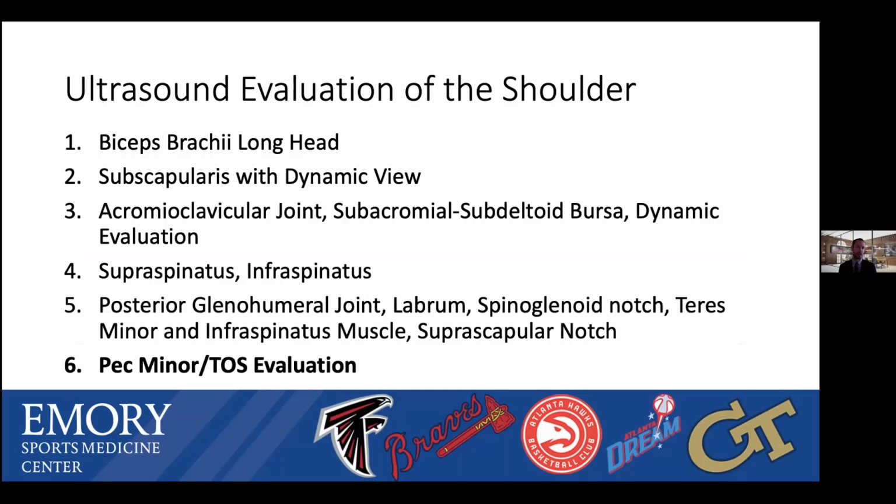So this is our standard evaluation of the shoulder protocol. So I used a 15.6 megahertz linear transducer. I've used the Sonocyte export machine.